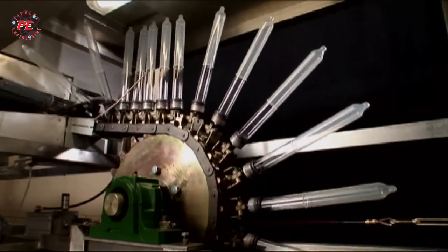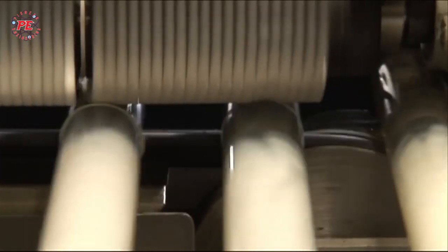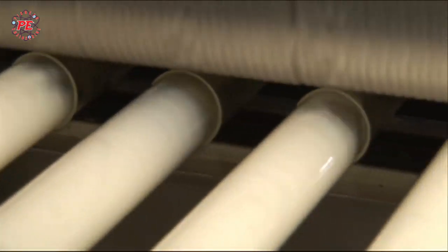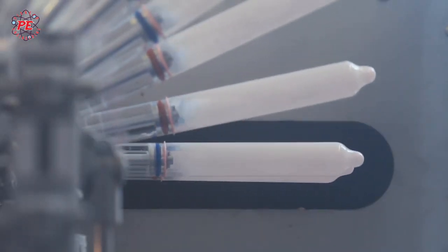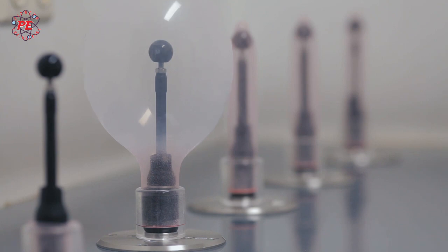Another important processing stage of condom production is the manufacture of the rolling rim. This spinner brush will roll over the top of the condom to give it a rim so it is easy to roll on, then it goes through the drying tunnel. The final drying process, called vulcanization, ensures the condom is more elastic so that it can be stretched at least twice as much without damaging it.